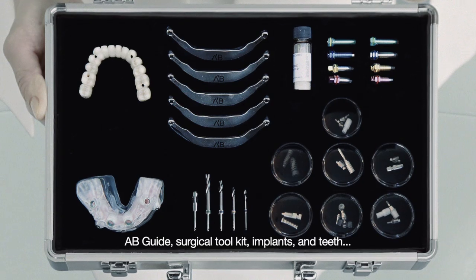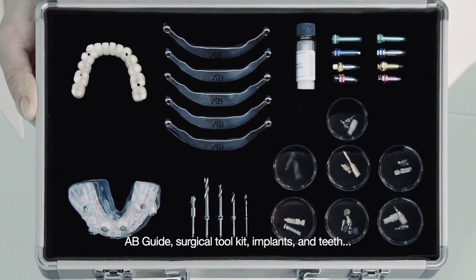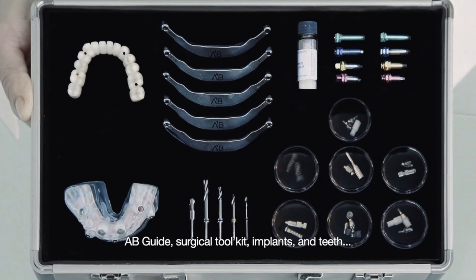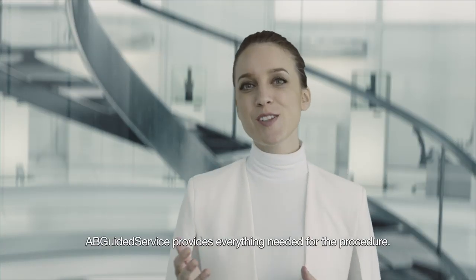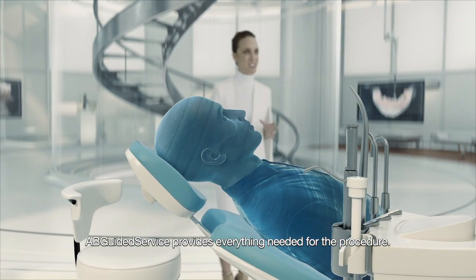Isn't it beautiful? AB Guide – surgical toolkits, implants and teeth. AB Guided Service provides everything needed for the procedure.